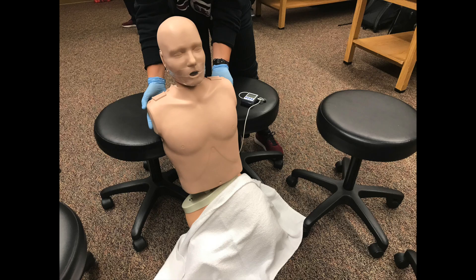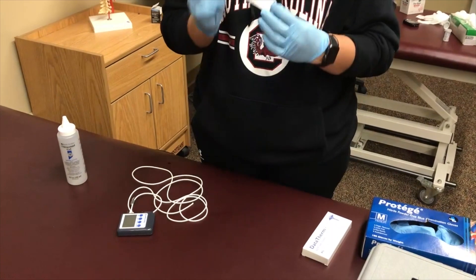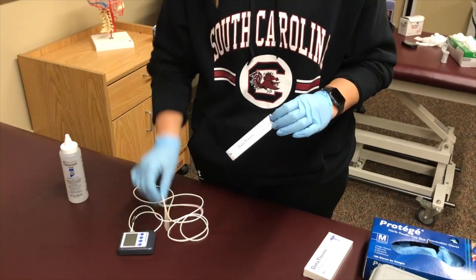First, you'll want to explain the procedure to the patient and let them know what is about to happen. Next, you will put your gloves on and place a protective cover over the thermometer probe.